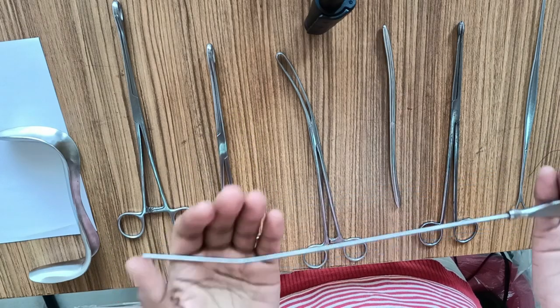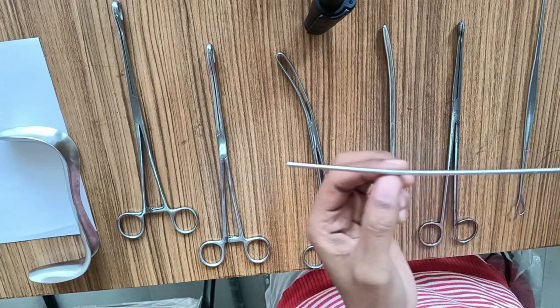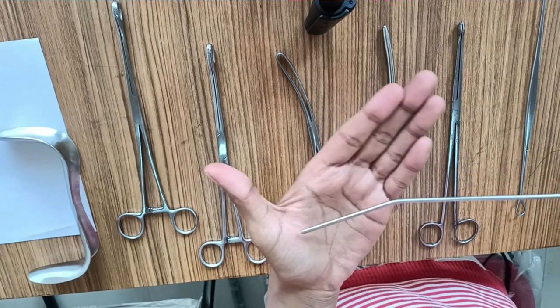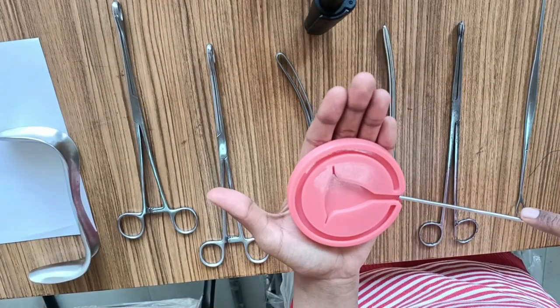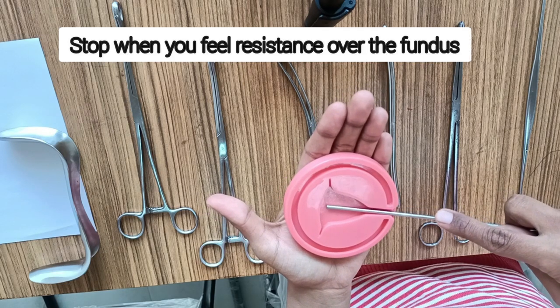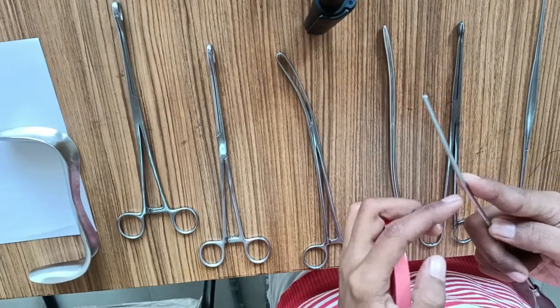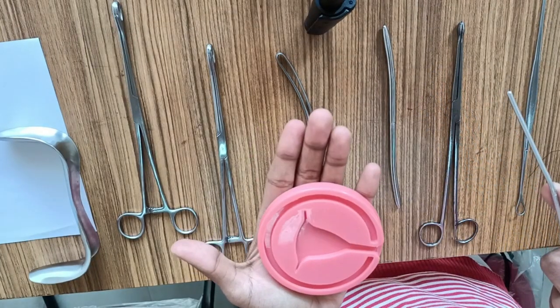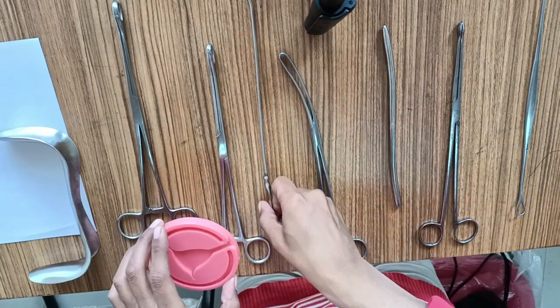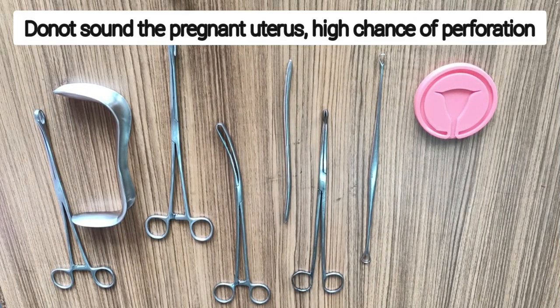This is a uterine sound — a thin metallic instrument whose forepart is bent at an angle to negotiate through the utero-cervical angle. It is graduated with markings in centimeters or inches and has a 2 mm diameter. It is used to measure the utero-cervical length: you go through the cervical canal all the way up to the fundus till you feel resistance, then place your index finger at the level of the external os and measure the utero-cervical length. It also helps in confirming the anteverted or retroverted position of the uterus and acts as a first dilator.